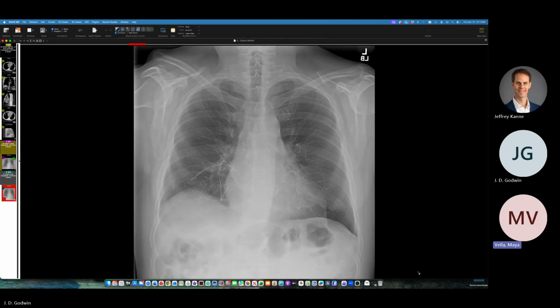But yeah, I've seen at least one radiograph also where that wire fractured and is clearly poking into the RV. Wow, you've seen it actually poke. Yeah. I think they went in and took it out and the patient was fine, but I've seen it where it's clearly going into the heart. Yeah, unpleasant. Yeah, we have one that's still lodged in the RV from like a decade ago that's been stable and they don't want to go back in and do anything with it because it hasn't caused problems. But the patient shows up like once a year for an annual radiograph and there it is. Same theory, it migrated, broke off, and this one just got stuck on its way.